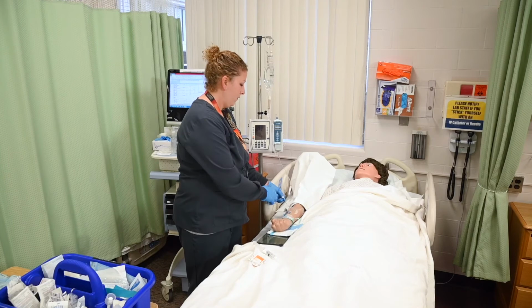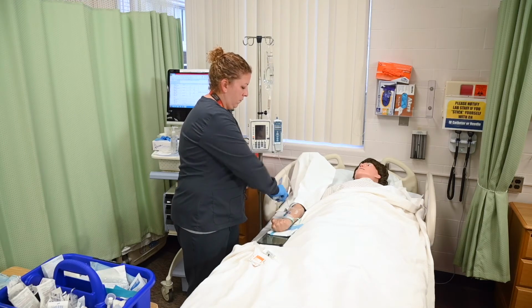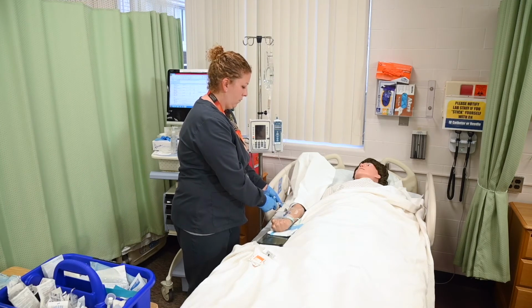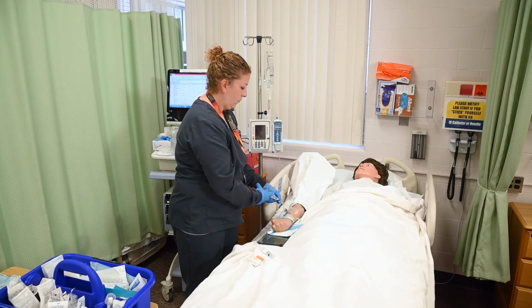Connect the 10 mL 0.9% saline flush syringe into the injection port using push and twist technique. Pull back gently on the plunger to aspirate for blood return. I have blood return. Slowly flush the injection port with saline flush.